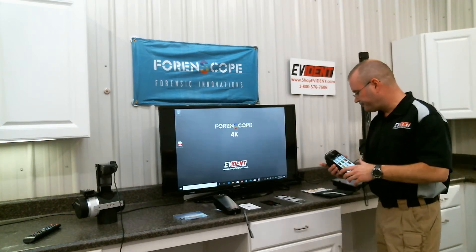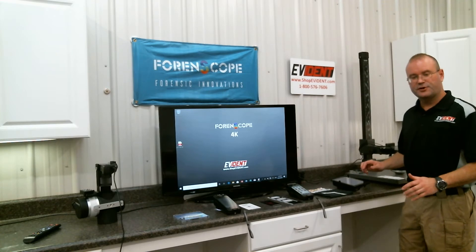It's a great tool for investigating sexual assaults. Easy device to use. Very affordable. We recommend this for everybody. Now let's talk about the Forenscope tablet.